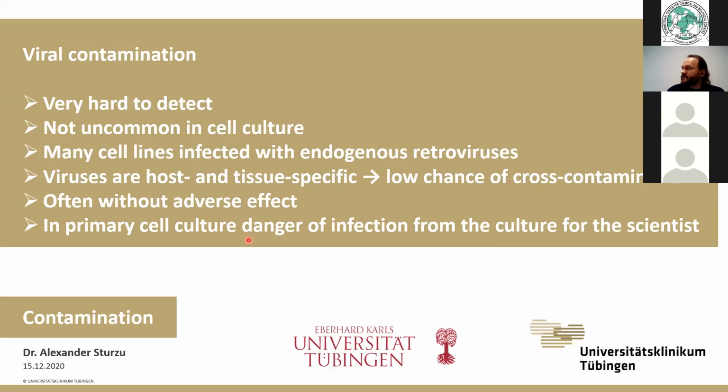One point where viral infection is dangerous is if you're working with a primary culture of endogenous cells, human material, then you as the scientist can be in danger of infecting yourself if your cell material was carrying viruses, like for example, hepatitis.